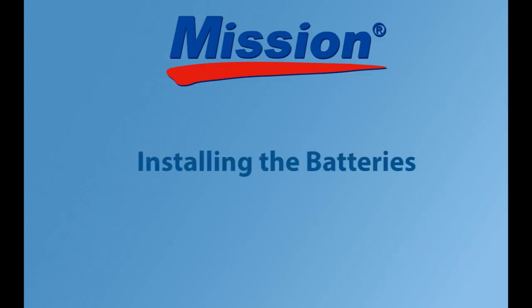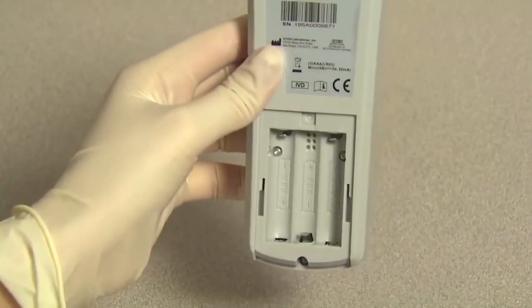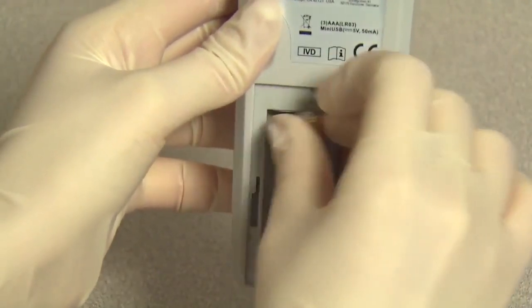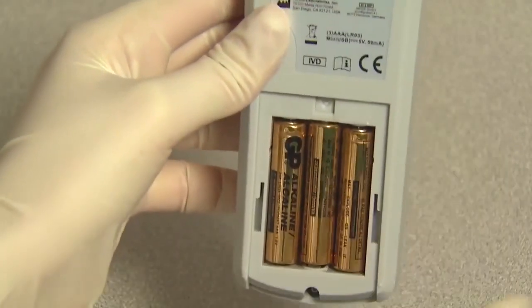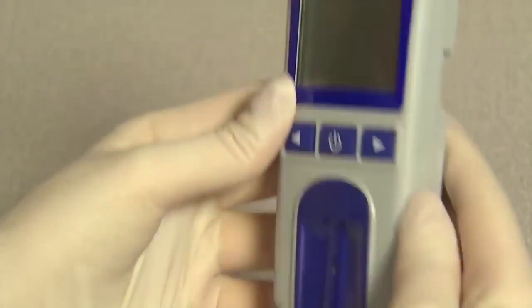Installing the battery. To install the battery, turn over the meter to locate the battery compartment cover. Press in the direction of the arrow on the battery cover and slide the cover down to open it. Insert 3 AAA batteries into the battery compartment. Close the battery cover and make sure it snaps shut.